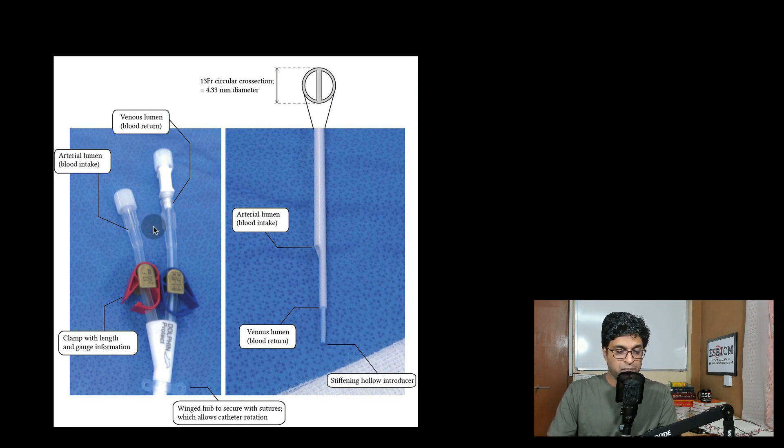Now there is a small difference, very important small difference in these two port openings. You can see here, this red port opens proximally and the blue port opens distally.